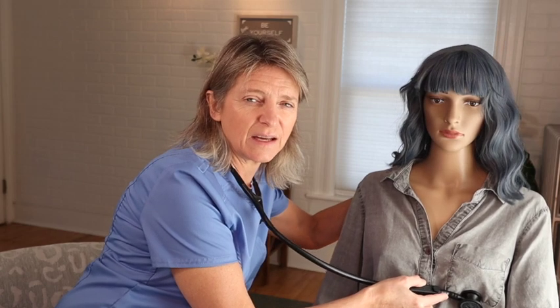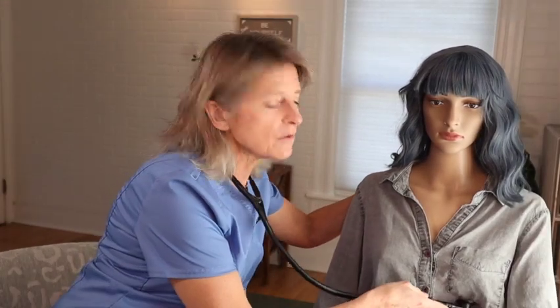So there you go. This is a good one to say lean forward because it brings the heart closer to the chest wall. And you can hear a little bit better when you ask them to move forward. But we'll just leave her sitting put. I don't want her to fall over.